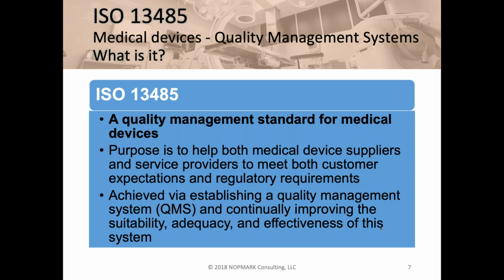So let's start with one of those quality management systems, one of those regulations. The big one that all medical device companies have to comply with, and at some point get certification to, is the ISO 13485 standard. This standard covers the way the company does development and manufacturing.